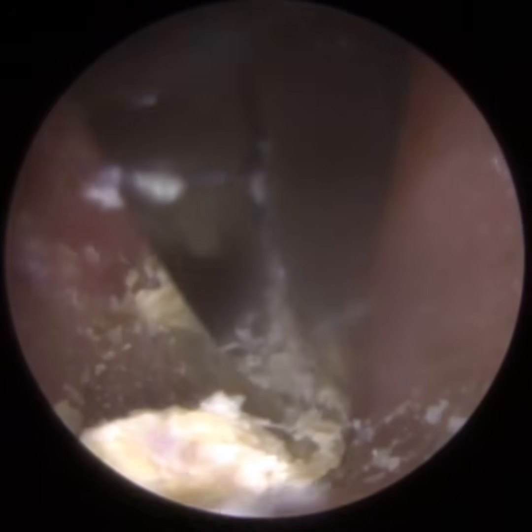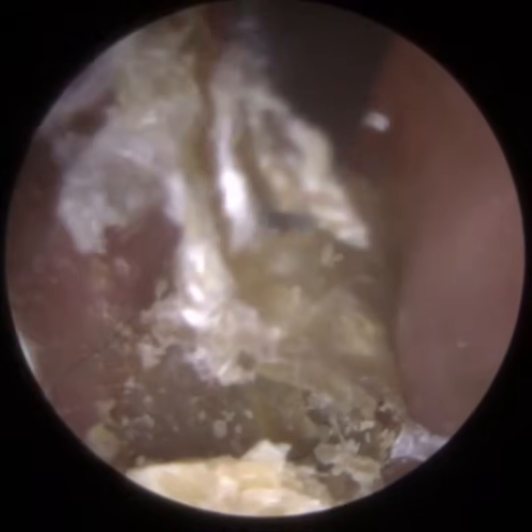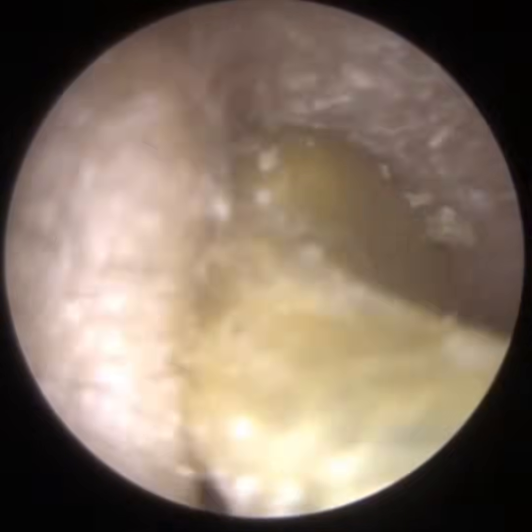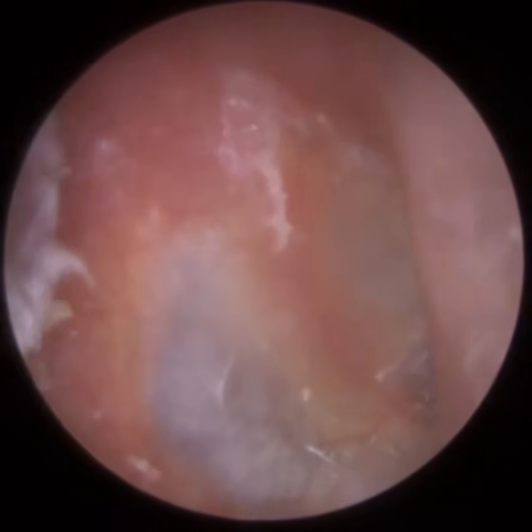The patient has got quite a narrow ear canal. You can tell that by how much the forceps is taking up the internal space of the ear canal. The patient is unfortunately very still for me to do this. There's that little wiggle I was making reference to earlier, and you can see on the right it's detaching itself from the eardrum, and slowly but surely I've managed to remove this from the patient's ear. It was a very rough piece of dead skin. It was like some plastic.